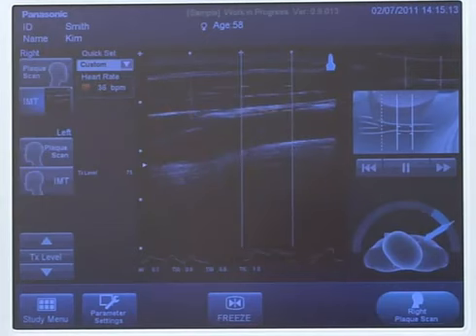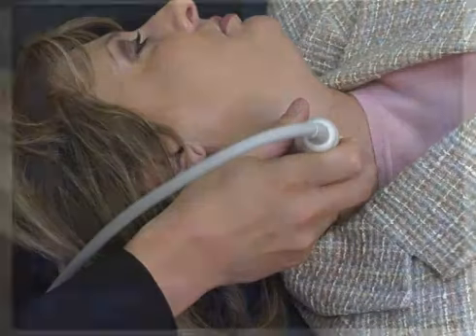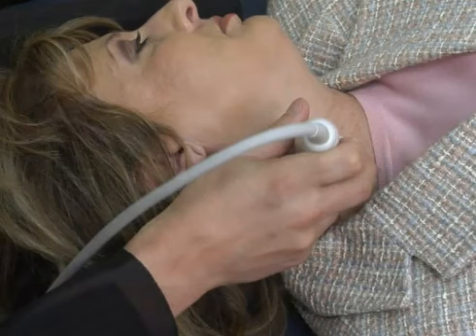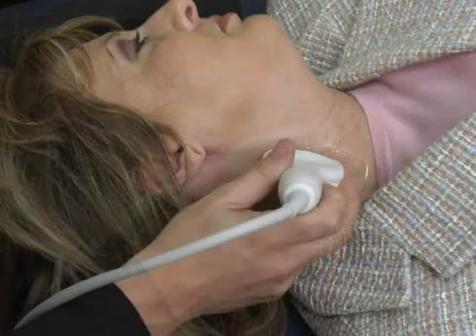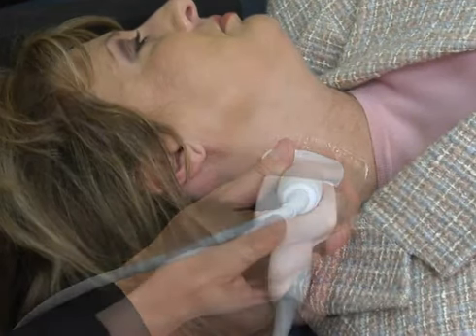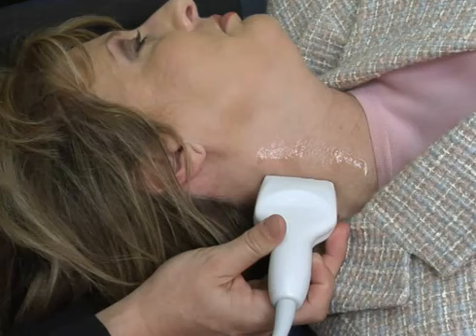You want to scan the patient's neck in three different angles: from the anterior aspect of the neck around 2 o'clock, then from a lateral aspect of the neck around 3 o'clock, and then the posterior aspect of the neck around 5 o'clock.